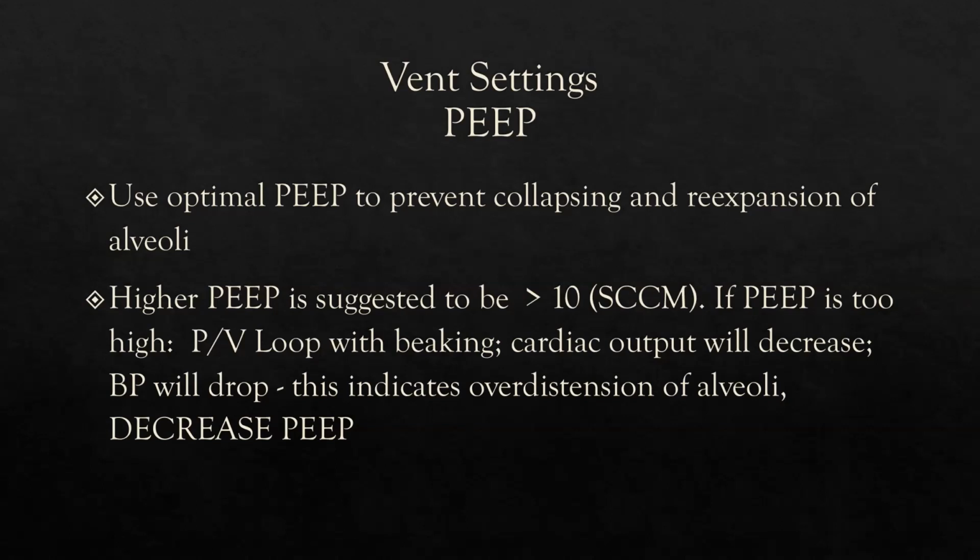And with blood pressure dropping, do you remember the optimal PEEP when you monitor some things and you start going up on your PEEP to see if you have enough PEEP? Do you remember what you monitor? Blood pressure was one. O2 sat, very good. So you're looking to see the O2 sats improving. That tells you when you have enough PEEP to keep the alveoli open.